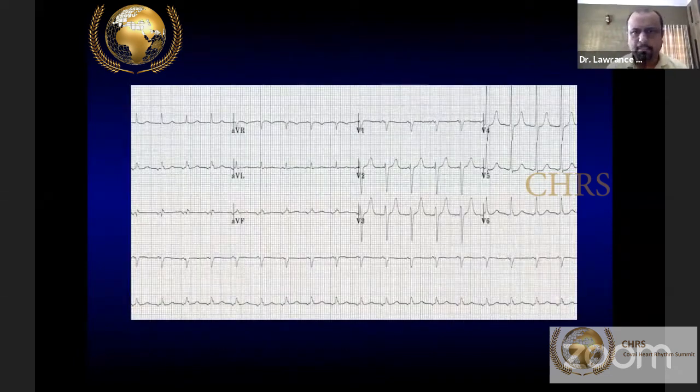So this ECG, again, you can see here, the heart rate is in the tachycardia range, more than 100 beats per minute. You can see a narrow QRS and it's regular. So you're looking at a narrow QRS tachycardia, which is regular. Next one, I'll always look at the P wave. Yeah, we can see here in V1, you can clearly see a P wave. So the same way I'm going to see RP and PR. Your RP interval is pretty long compared to the PR interval. So you are dealing with a long RP tachycardia.